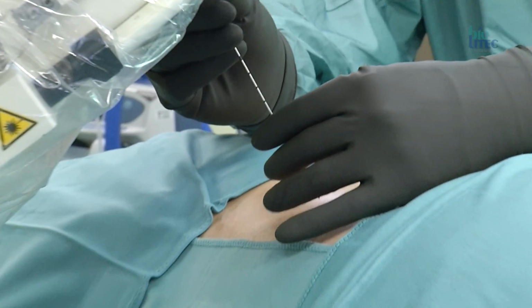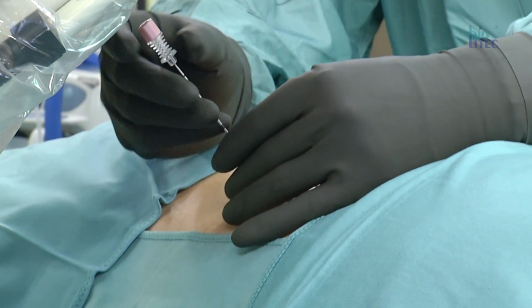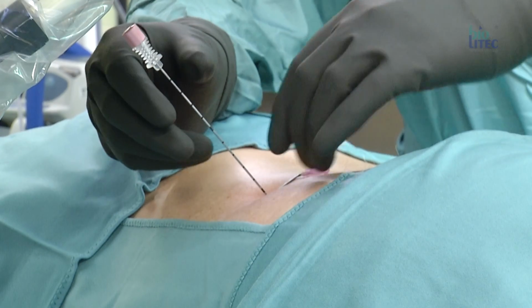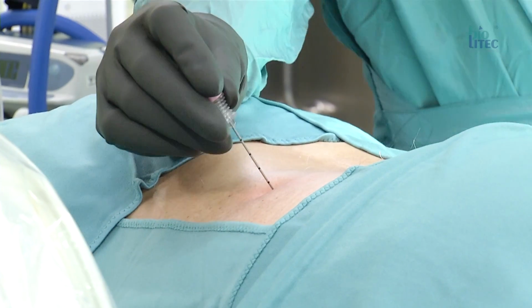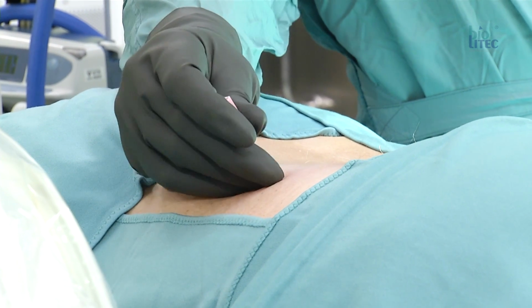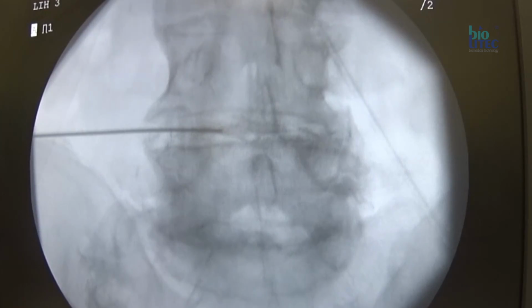The nucleotomy at the lumbar spine is carried out with an 18G needle under fluoroscopic guidance after local anesthesia. The right position of the tip is the dorsal 1/3 of the disc. It is important to maintain a parallel alignment of the needle between the vertebral bodies. The right position should be controlled in AP and lateral view.